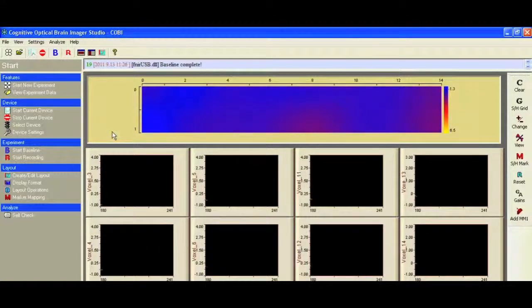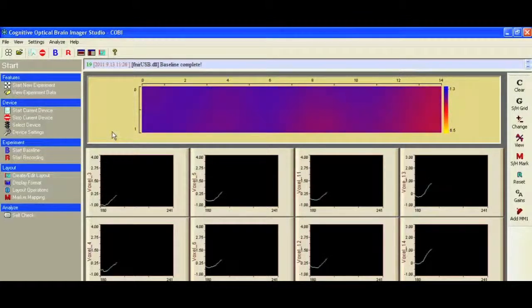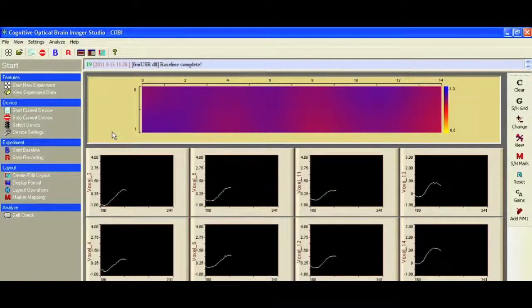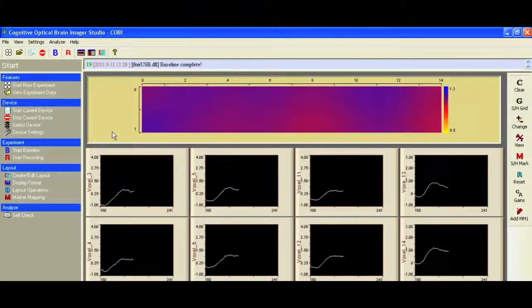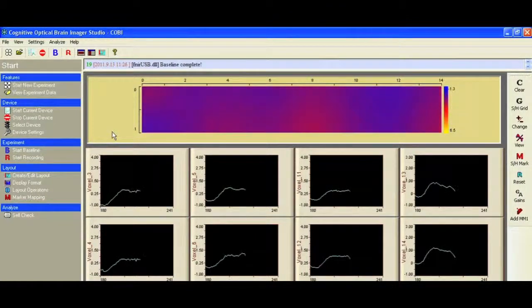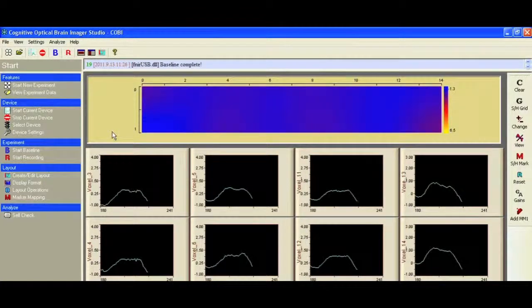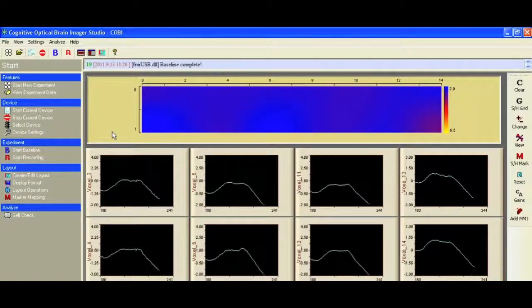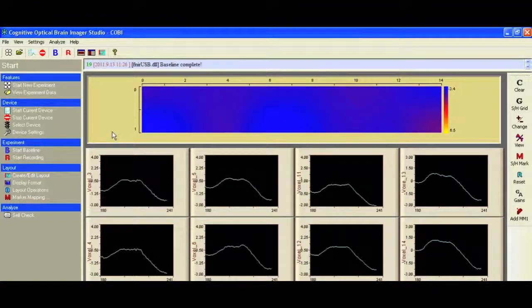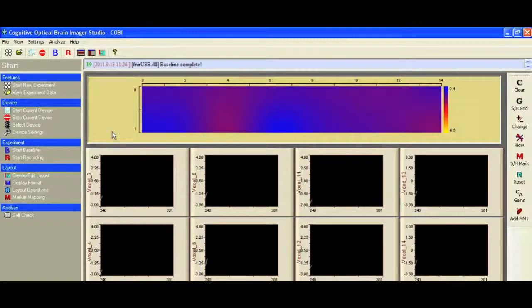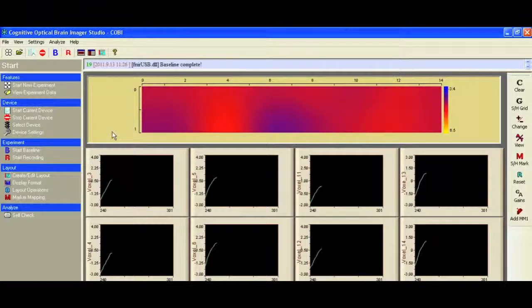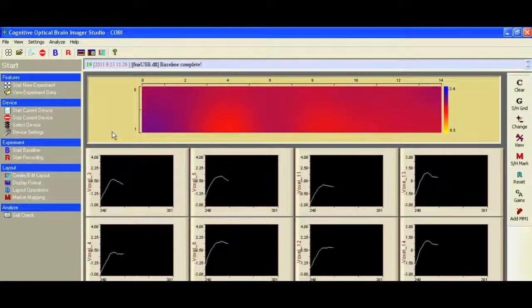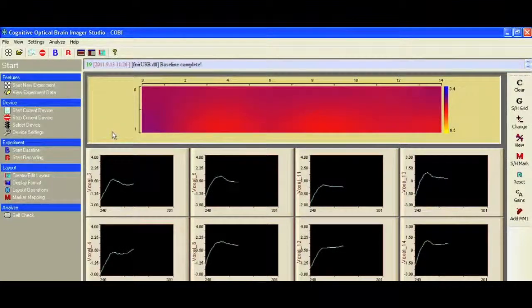We'll let that stabilize a little bit. In a second I'm going to ask them to take a deep breath and hold it in for a few seconds. If you can take a deep breath please. Okay, and then if you can relax, release the breath. Okay, so those are some simple little tests you can do just to make sure that the signals are responding the way they should.